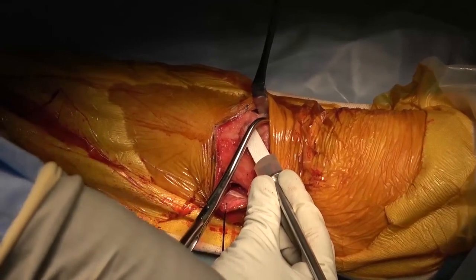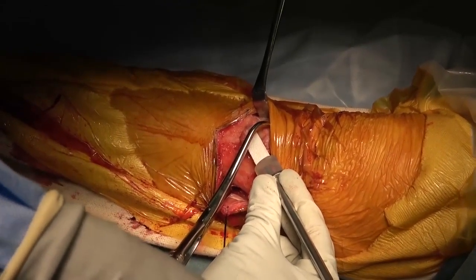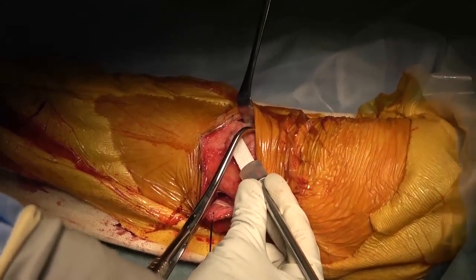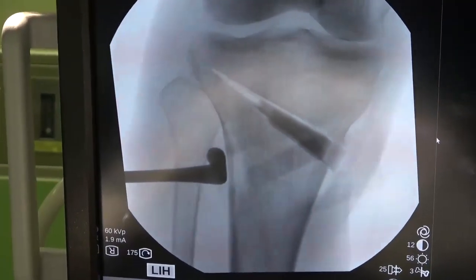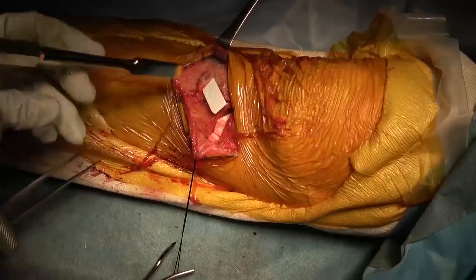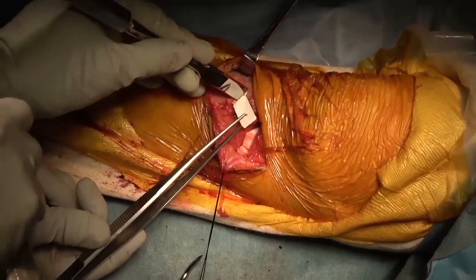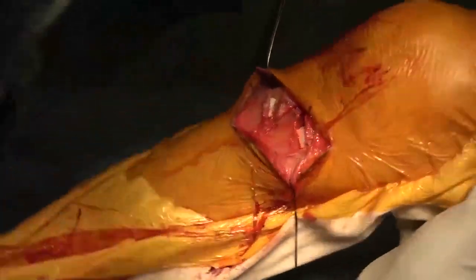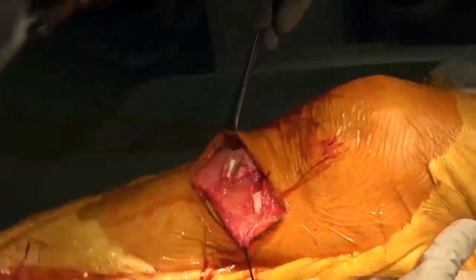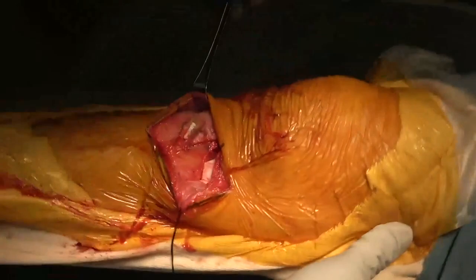As a result, the distal end of the tibial tuberosity fits snugly behind the tibial diaphysis, creating a stable retrotubercle configuration resembling a mortise and tenon joint. At this point, a stable retrotubercle in knee flexion and extension can be confirmed even before plate fixation.